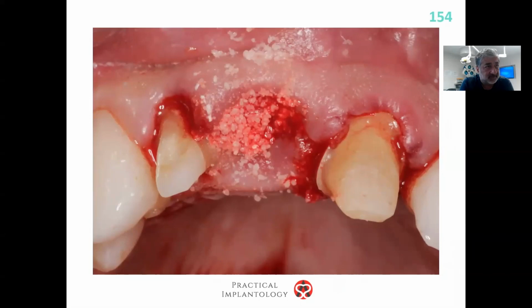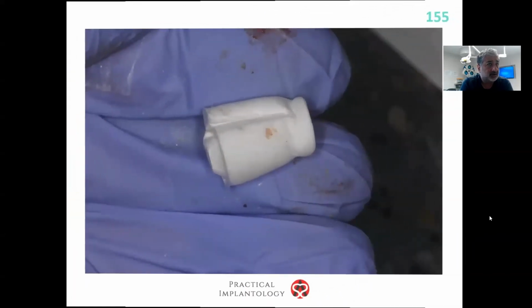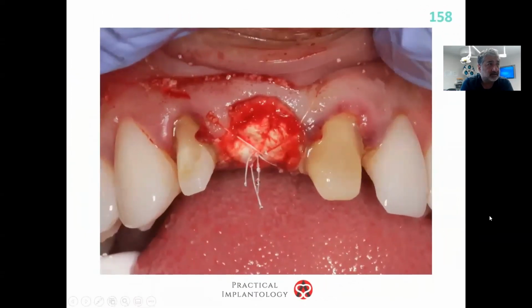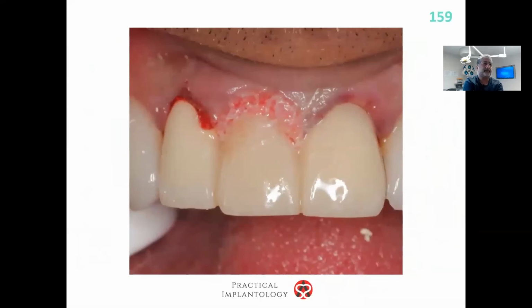I added my 50/50. I added my Ethos here. I then took my collagen sponge. I squashed it, as I said before, and I placed it over the area. And I did a cross suture over the top. This can be 2 interrupted sutures from one angle to the other, or it can be 1 continuous cross suture, which we can show you how to do. I then put cyanoacrylate over the outside, on the inside of the pontic.